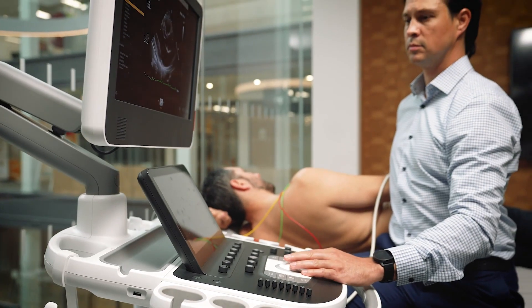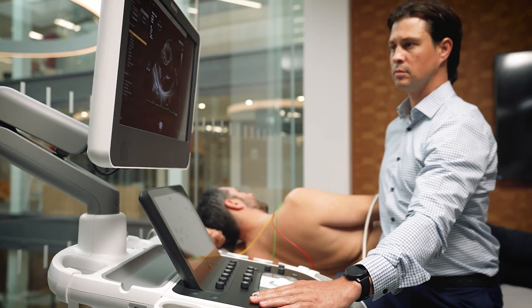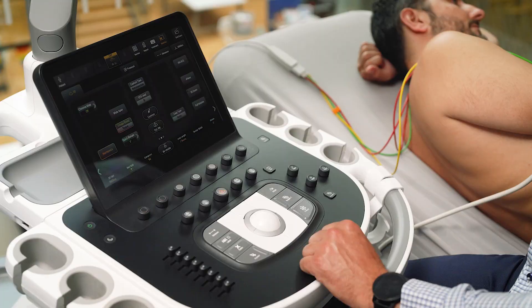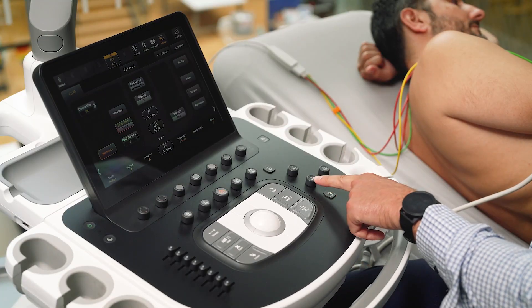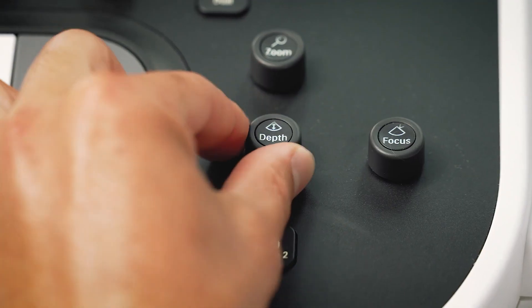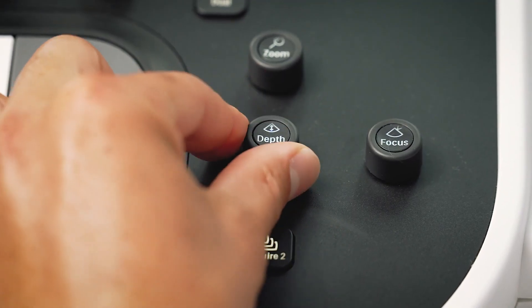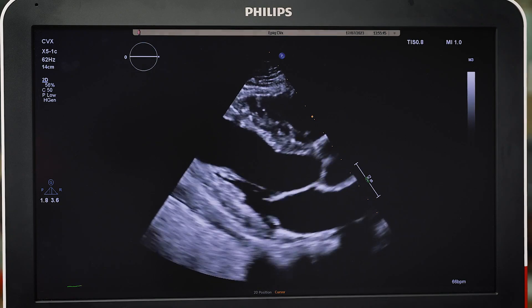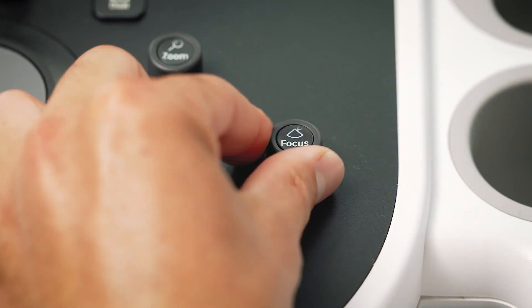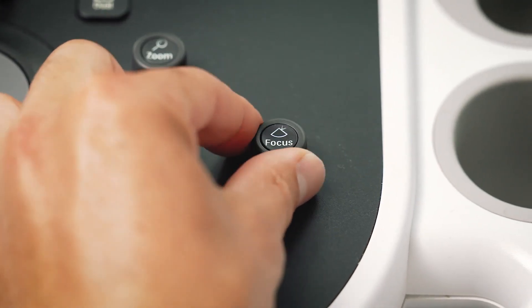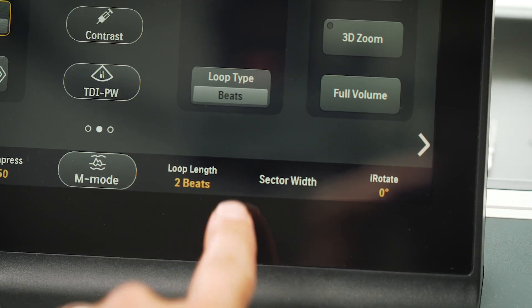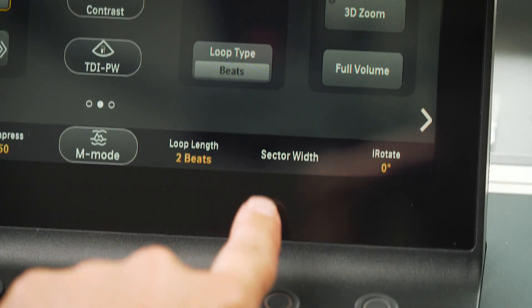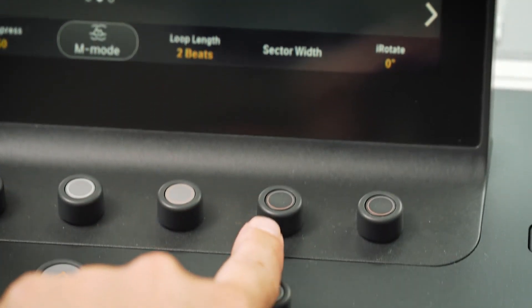Firstly, as is standard practice, I'll begin by reducing the depth, moving the focus and sector width as appropriate for my structure of interest.